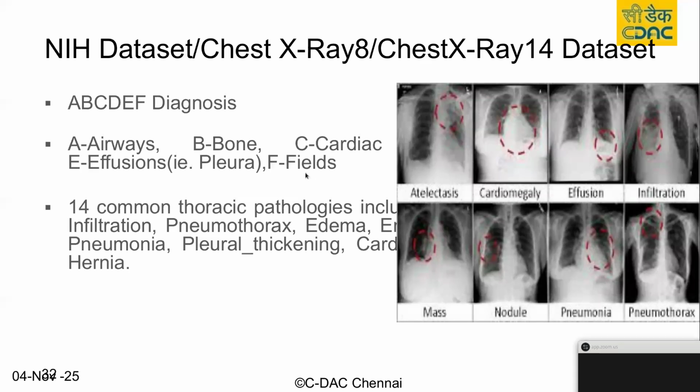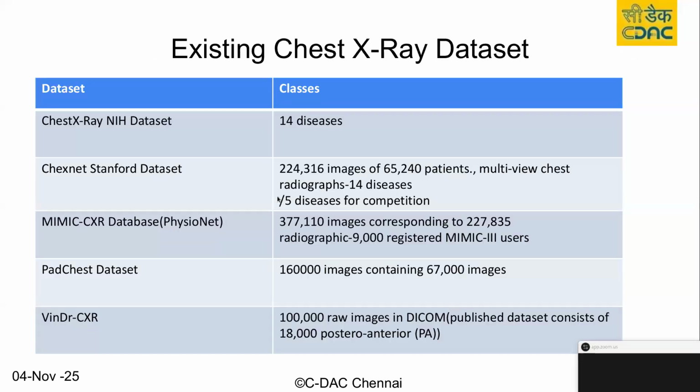So this was a method for finding abnormalities in each of these body regions that doctors were looking at. But for machines, we have to train with the images which are abnormal, so that later the neural networks become brilliant enough to understand these diseases. That's the methodology we follow in machine learning algorithms.